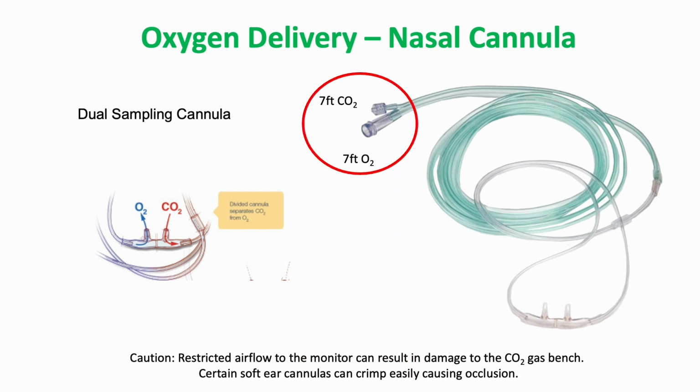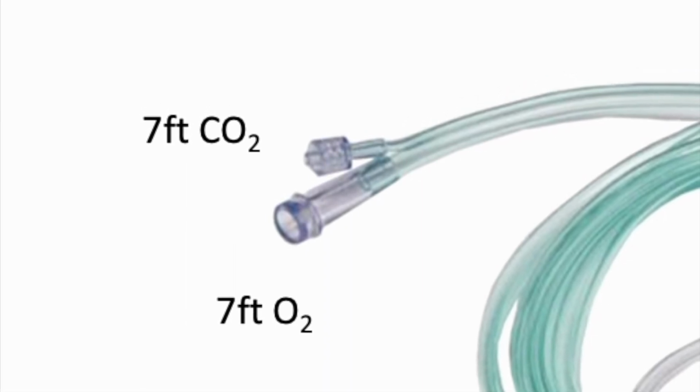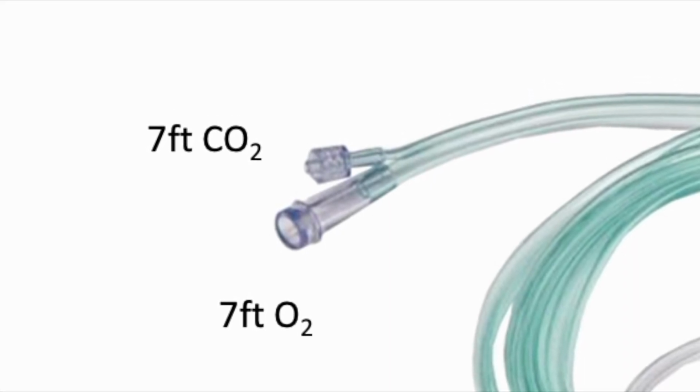When the cannula is first removed from the package, it may appear that the line is all one piece. Pull the ends apart to separate the oxygen line from the CO2 sampling line. The line with the luer lock will attach to the monitor. The O2 port attaches to the oxygen source.